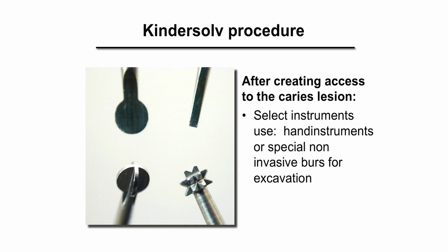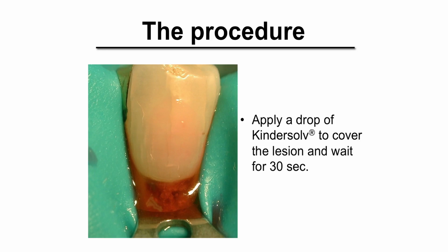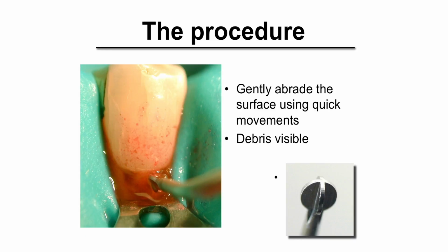After creating access to the caries lesion, select your instrument of choice. It could be a specially designed hand instrument, or a hand excavator, or special non-invasive burrs for excavation. Apply a drop of Kindersolv to the lesion and cover it completely. Wait for 30 seconds. Then start to gently abrade with quick movements. And as you can see here, already after 30 seconds, you can see debris visible.